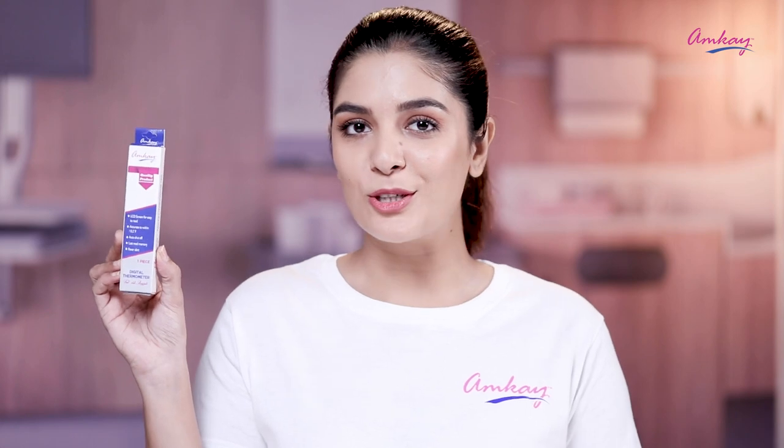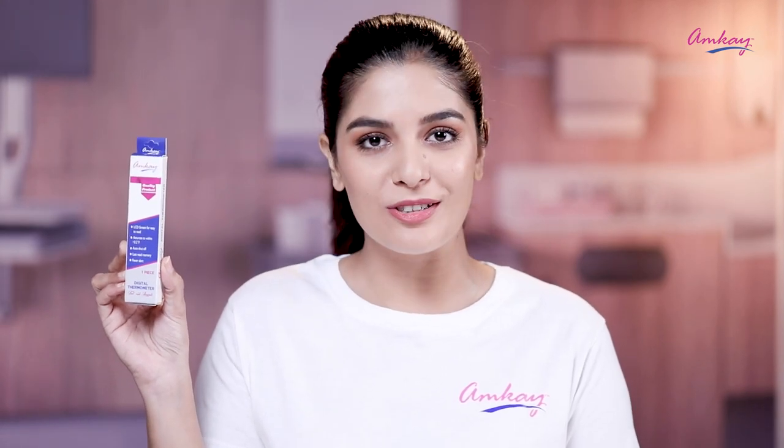A thermometer is the first thing you need when you have a fever — but what you actually need is a thermometer that gives you accurate results. The solution to this problem is the Amkaze digital thermometer, which is trustable and reliable. Presenting the Amkaze digital thermometer that helps you check your accurate body temperature real quick.